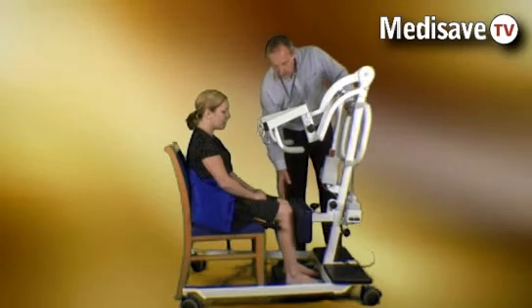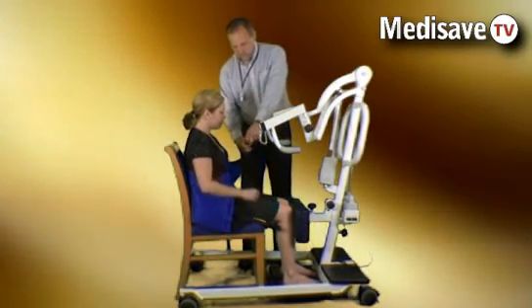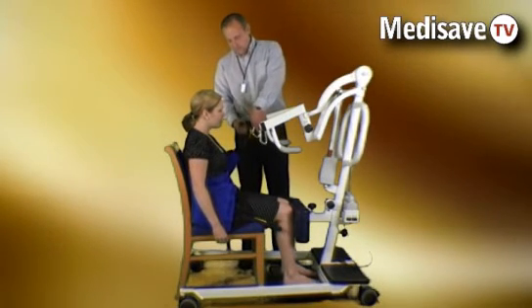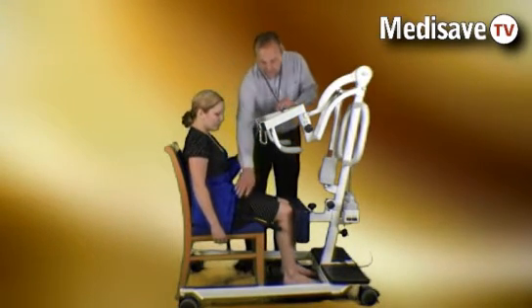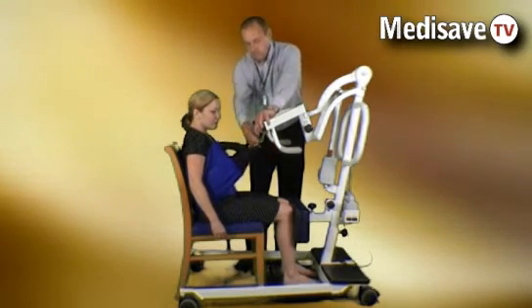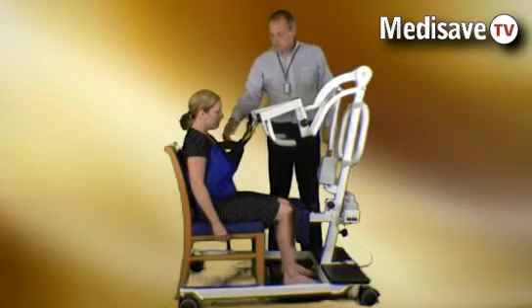The feet go on the foot plates and the shins to the shin pad. The stander hoist sling, which goes round the waist, is then attached via carabiners, and the patient is stood.